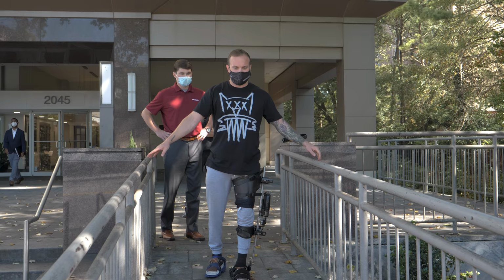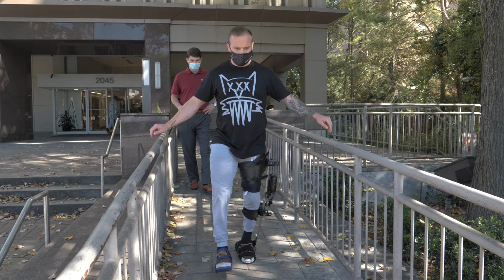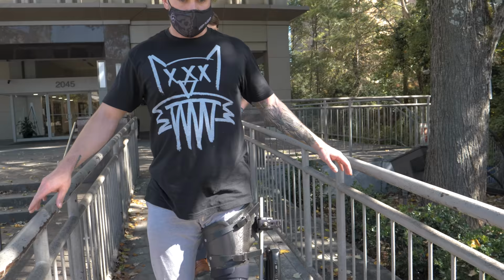You're not going to hear a beat if you're going down an incline. You're not really ever going to get the full extent. And that's why the resistance is up, because it knows you're going downhill. Remember that gyroscope.